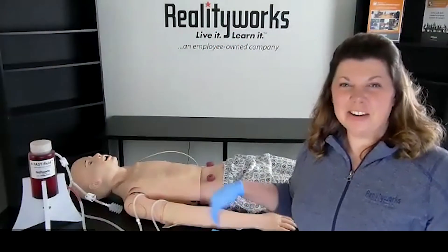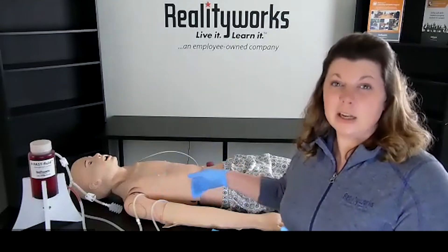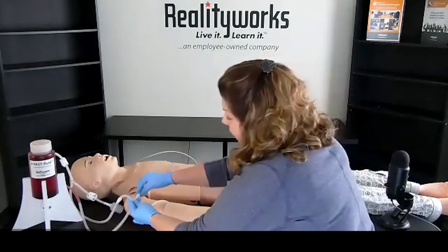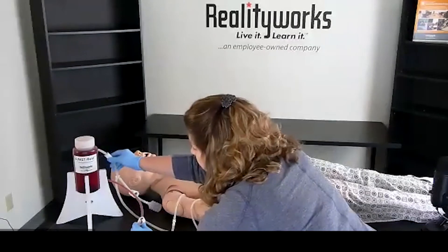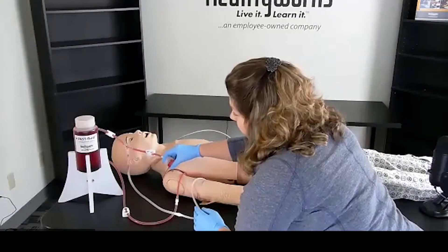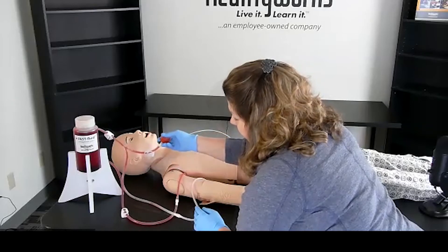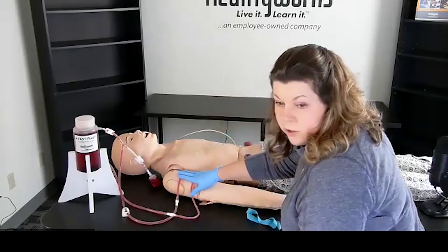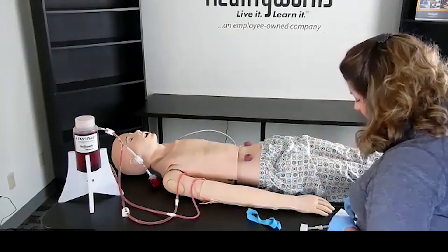Now I'm going to demonstrate how to insert an IV on our adult nursing mannequin. First you're going to have to prime and connect your fast fluid management system. What I've done already is connected it to the two tubes that are in the arm. You're going to open up both areas and use the plunger to prime the mannequin. As you notice here, all the tubing is basically primed with the blood that we'll be using.